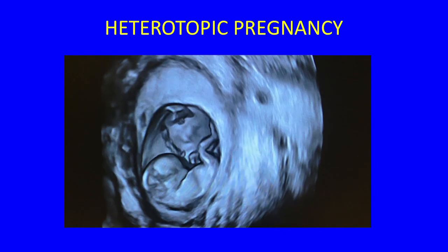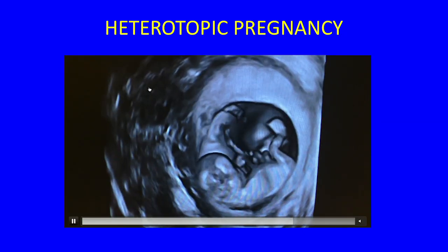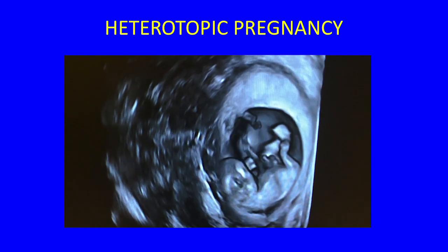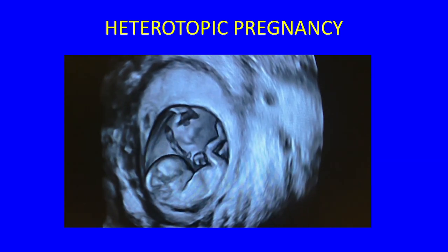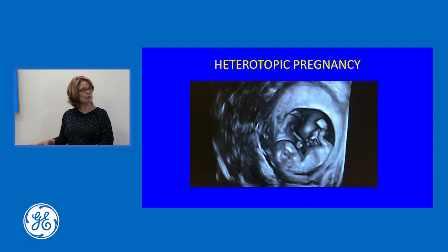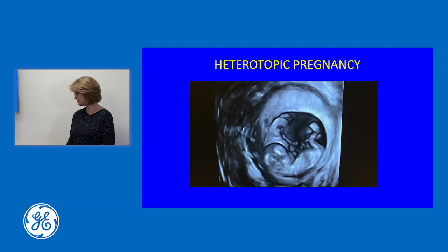see what turns up. And what you can see is, you can see the intrauterine pregnancy, and there is the ectopic pregnancy. I'm sure she had an ectopic pregnancy as well as a viable intrauterine. She ruptured the ectopic, but the pain settled and she was never operated on, and the intrauterine pregnancy continued. So if you look, you'll find that she didn't have an ovarian cyst. They were two corpora lutea in the same ovary.